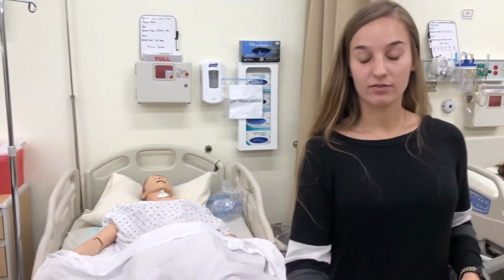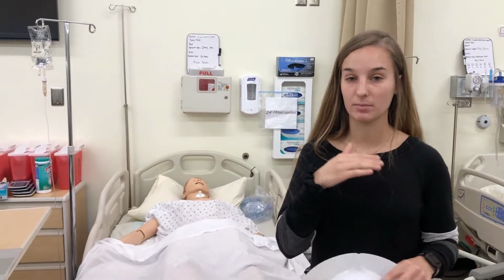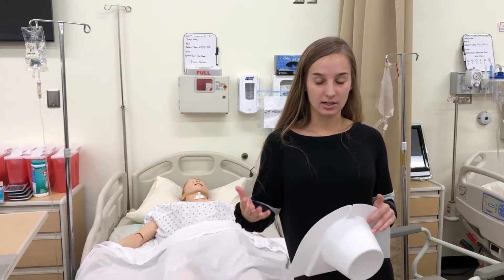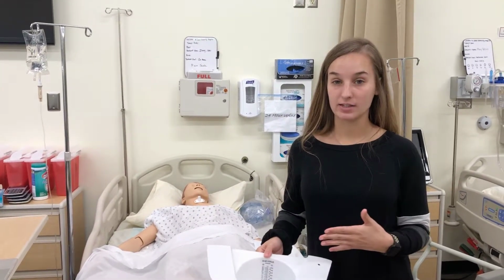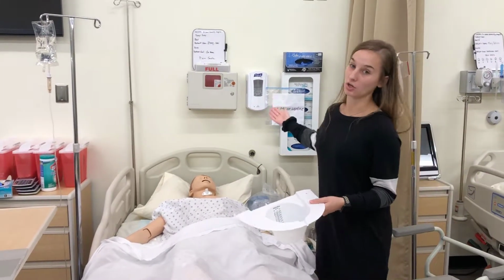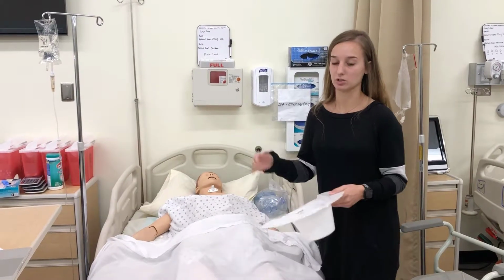The first urine of the morning would actually be considered old urine, so we would discard it because that's urine that has been accumulating over the nighttime. And then the second urine of the day would be considered the first. After that one, that's when you would put the start date and the time, and then 24 hours from then would be when you would stop.